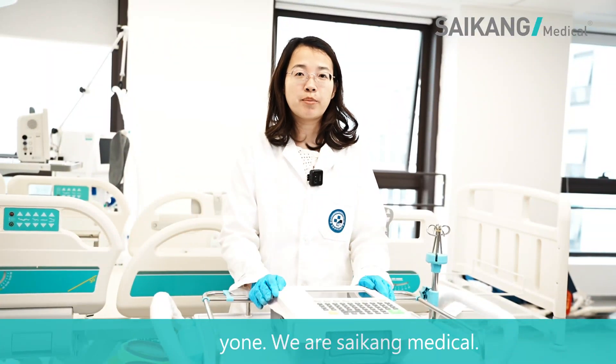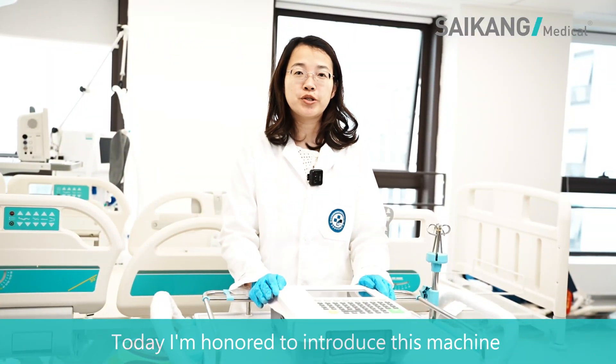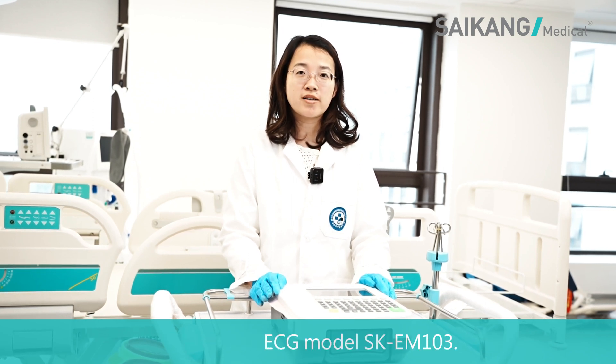Hello everyone, we are Saikon Medical. Today I'm honored to introduce this machine: the 12-channel ECG, model SK-EM103.